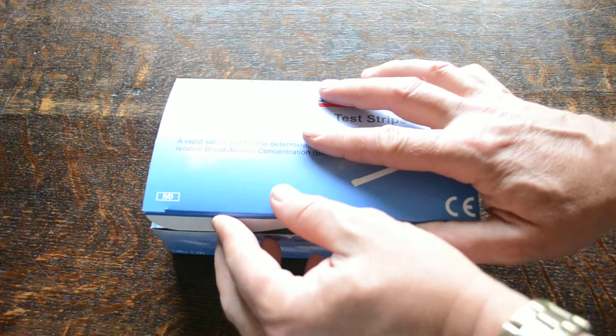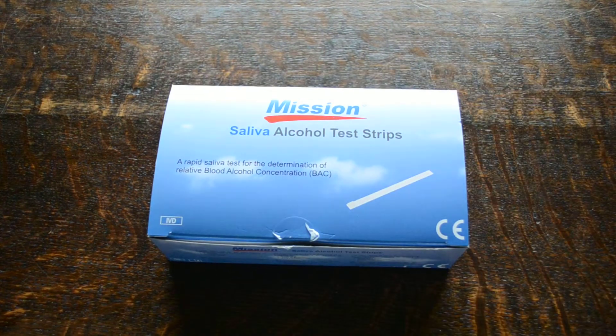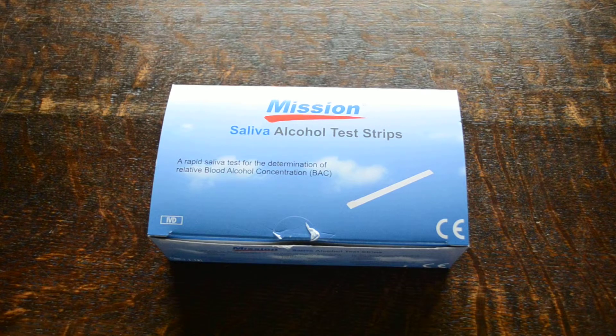So there you go — this has shown you the Mission Saliva Alcohol Test Strips. A very useful tool for determining if somebody has alcohol in their system. It can also be used to detect the presence of alcohol in any liquids, but non-quantitative as covered. It comes in packs of 25 test strips and is available from UK Drug Testing, Valubreethylisers, and Valumed through our websites online.